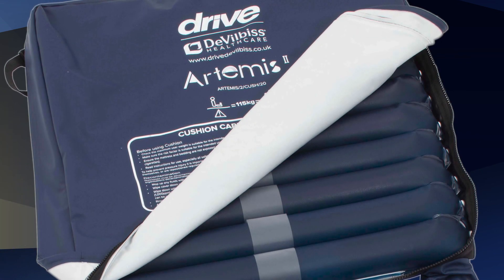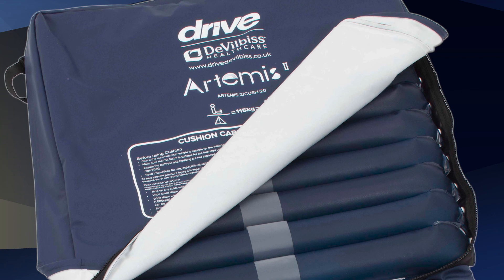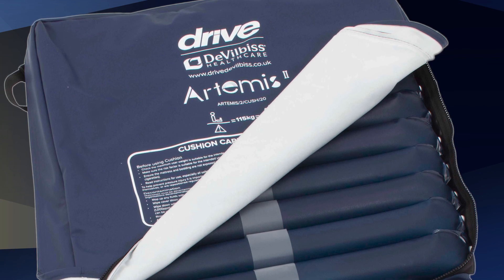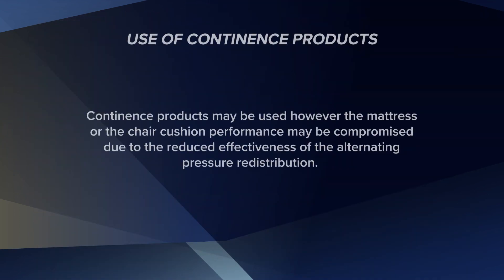The chair cushion cover is multi-stretch, vapour permeable and water resistant. The chair cushion has a white inner substrate on the underside of the cover, which helps auditing procedures by making staining easy to identify if the cover has become compromised. Incontinence products may be used; however, the mattress or chair cushion performance may be compromised due to the reduced effectiveness of the alternating pressure redistribution.